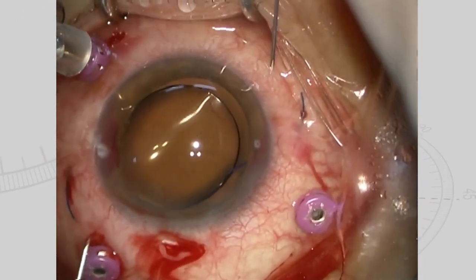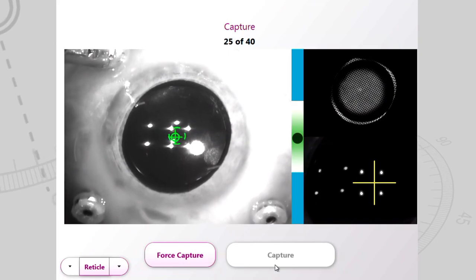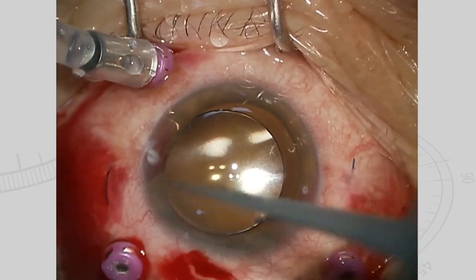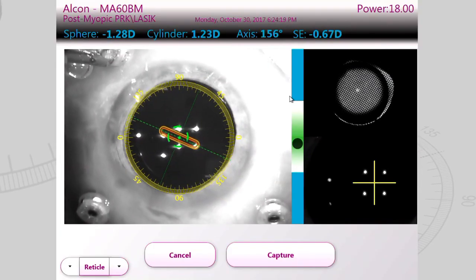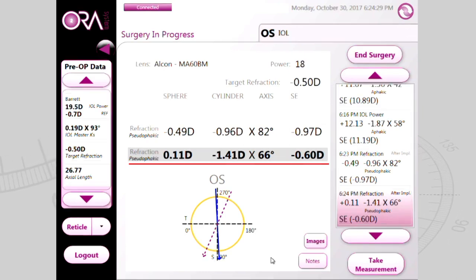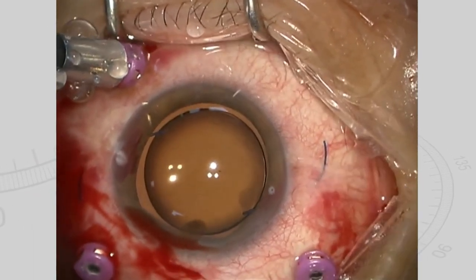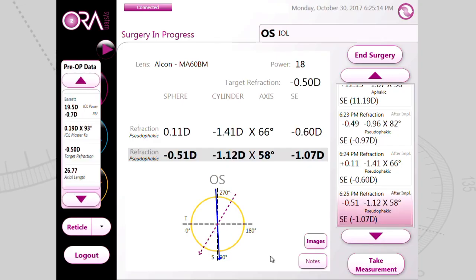With the haptics being pulled out at the maximum, we measured the refraction using an intraoperative wavefront aberrometry. The spherical equivalent was minus 0.97 diopters. We then pressed back the haptics inside the eye and measured the refraction; the spherical equivalent changed to minus 0.60 diopters. When the haptics were pulled out once again, the eyes became myopic, with a spherical equivalent of minus 1.07 diopters.